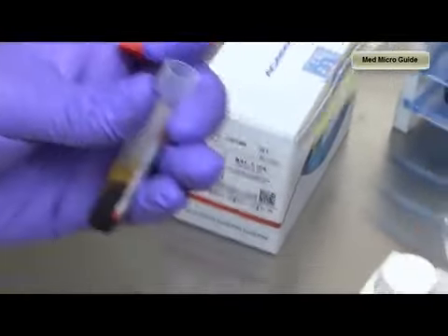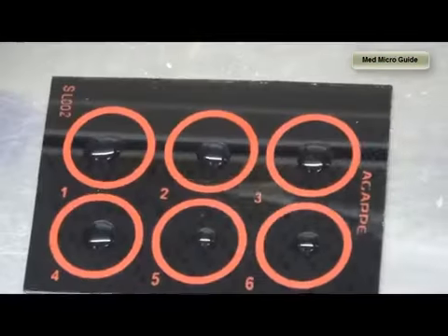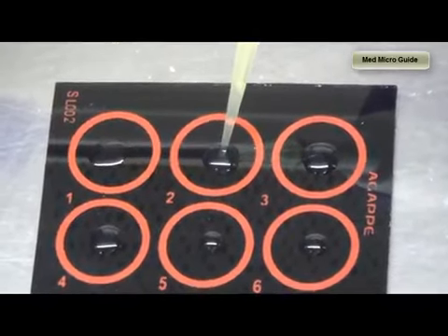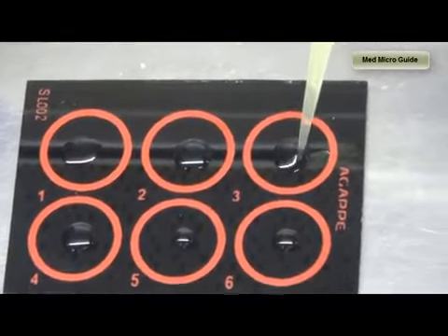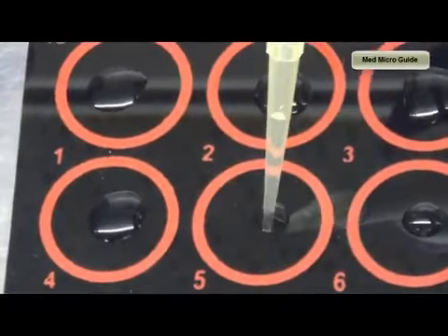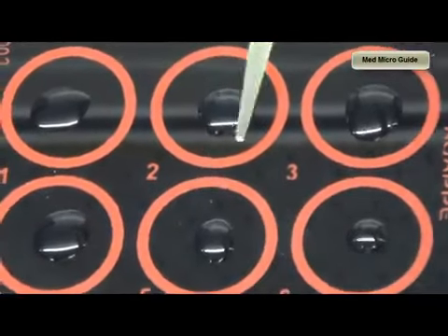So when we mix the 50 microliter of serum with 50 microliter of the saline, the final dilution will be 1 in 2. So now from the first circle, we will transfer 50 microliter to the second circle. Like this, we will go on diluting the serum from 1 in 2, 1 in 4, 1 in 8, 1 in 16, 1 in 32 to 1 in 64.